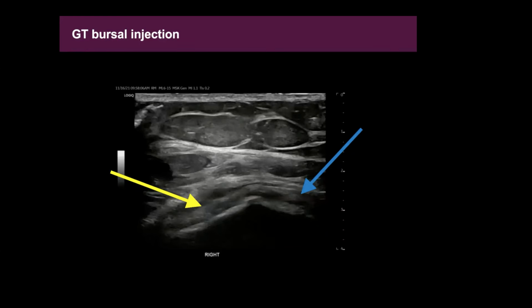So a lot of the times we would look to see if the tendon is intact. If it's not intact, then that's where our examination would end. We would say gluteus minimus tendon tear, and that's pretty much all we do. But if the tendons are intact, well, the patient's pain is likely not coming from those tendons. So then we go one step further and inject something like the greater troch bursa, of course, if that's what's requested by the referring physician.